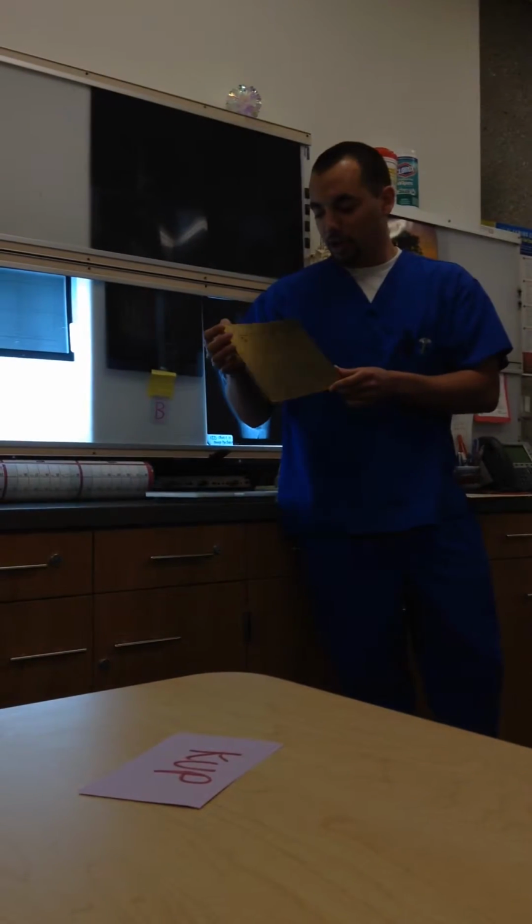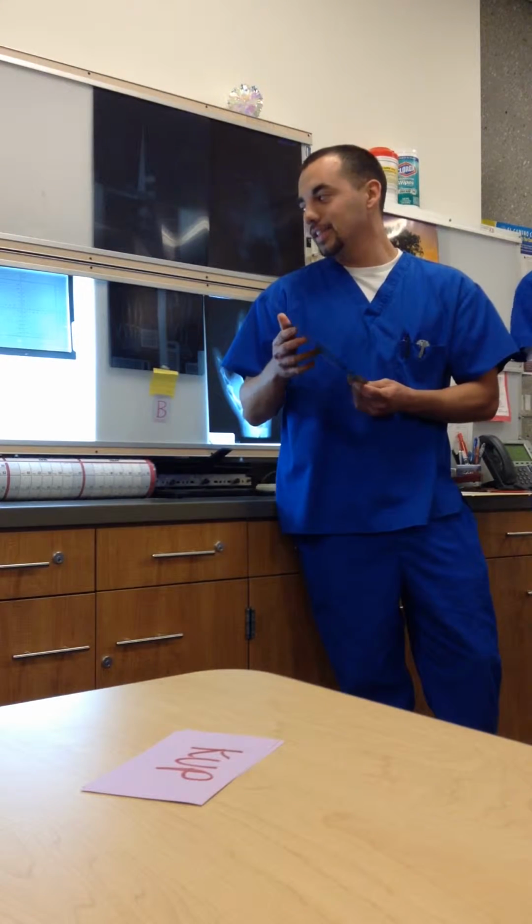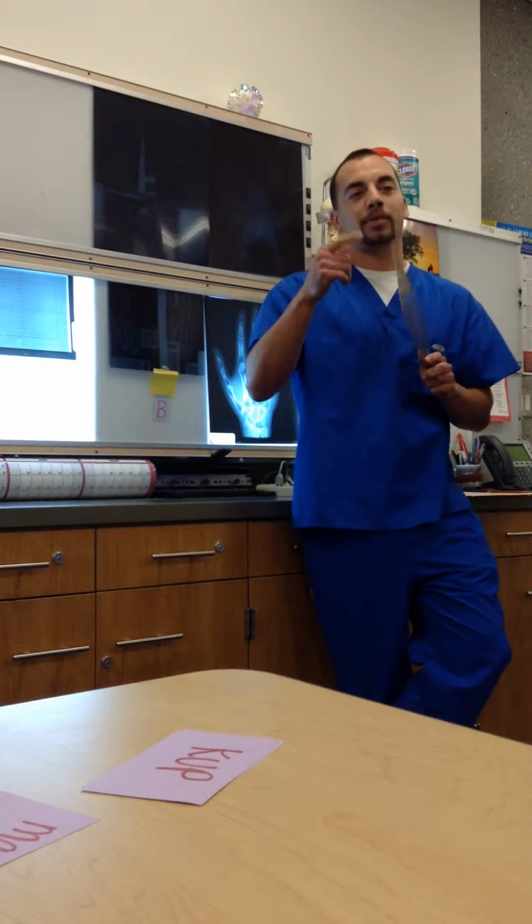Okay, go ahead. This is called the collimator test tool, and it tests the beam alignment. And what else? And this also. Well, actually, that isn't. You stole that from you. You should have this. You didn't let me finish. Who's got the focal spot QC? You should have that one. There was a different one back there. Yeah. That's the one I thought that was. Yeah. There you go. Does anybody know about this?